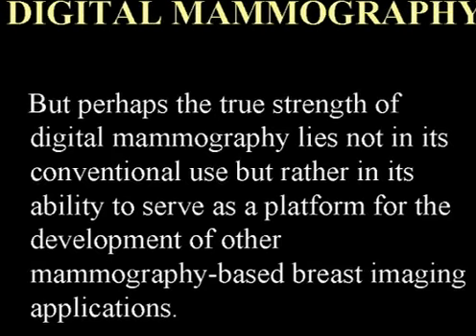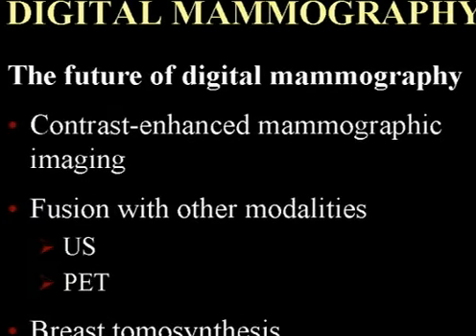But perhaps the strength of the digital modality doesn't lie directly in its two-dimensional current depiction, but really in the fact that it now allows us to develop other technologies. What are they? Contrast-enhanced mammographic imaging. Because the digital modality can acquire and read out images so quickly, can we inject contrast and essentially perform an MRI using X-ray technology? How about fusion with other modalities, such as ultrasound or PET? And one topic that I'm going to talk about a little later in the morning, breast tomosynthesis.